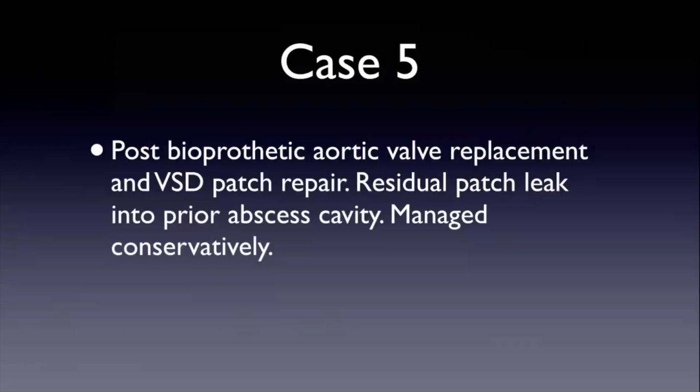Anyways, the patient was stable. Didn't go back to the OR, just managed conservatively. It was a very complicated surgery. How I was seeing it was that the valve was pretty much falling apart. There was a big abscess cavity. There was a VSD from the infective endocarditis. Patient was doing well. There's no way the surgeon was going to go back in. It's like, why did you even do the study? I don't want to know this.